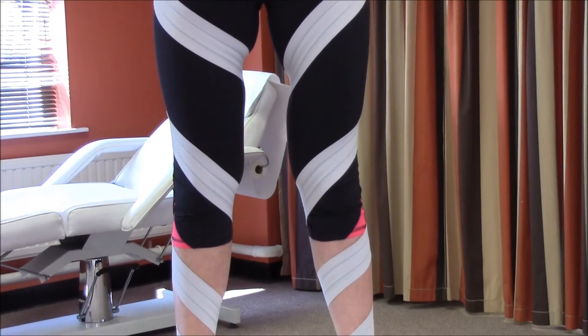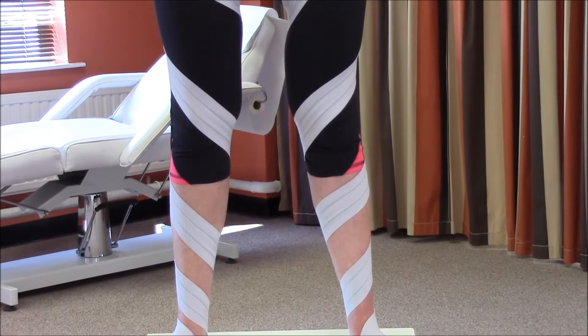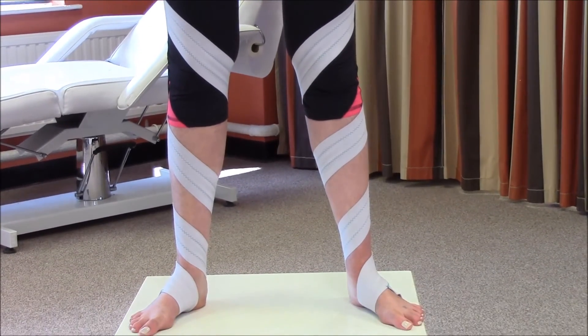If more correction is needed, increase the tension of the strapping if the patient is comfortable to do so.